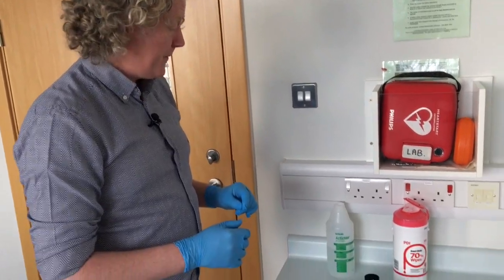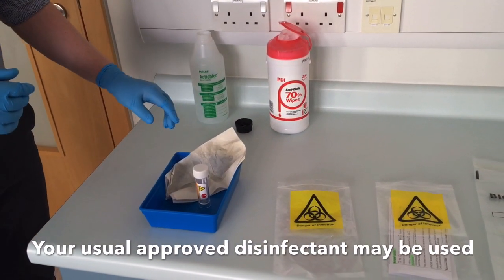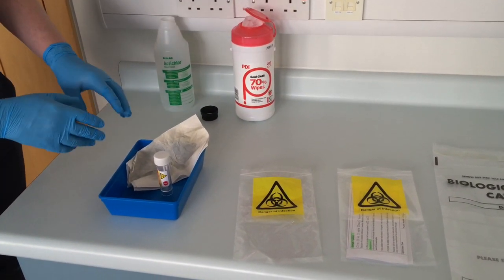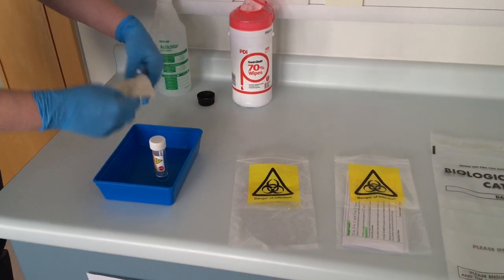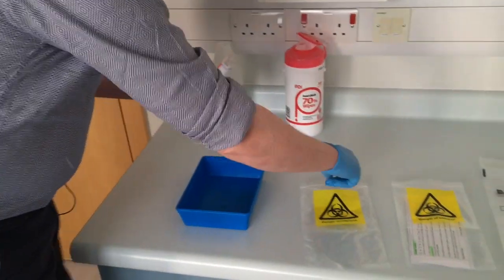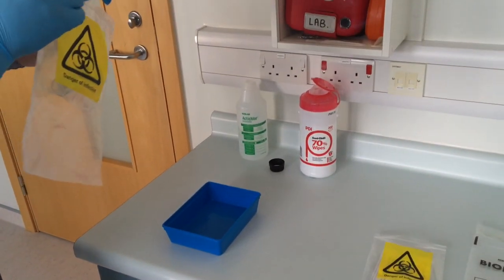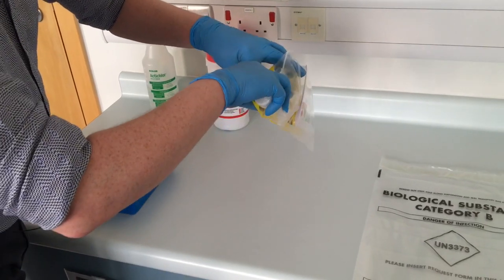Outside the room, we're going to safely package up our sample for transport to the laboratory. We have a wipe soaked in Actichlor Plus, and we're going to use that to decontaminate the outside of the universal container. You can use alcohol wipes as well, but be careful that you don't degrade the patient label on the specimen container. Give it a nice wipe down, then drop it into the first specimen transport bag, seal that up.